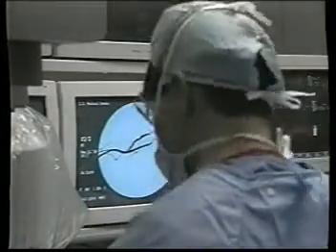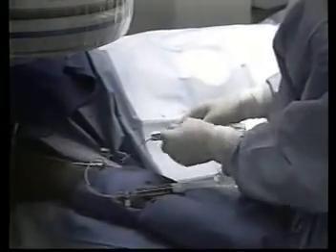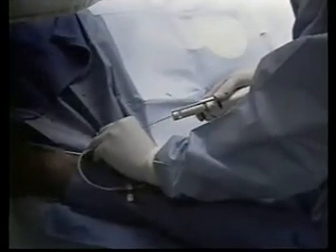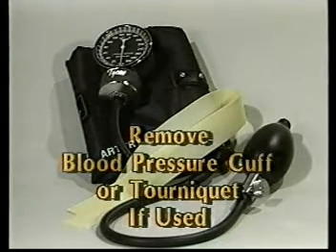Aspirate approximately 10 cc's of homogenized clot from the arterial sheath and discard the aspirate. Inject contrast to assess the degree of thrombus removal. Treat any residual thrombus using the PTD via either the venous or the arterial sheath as needed. If a blood pressure cuff or tourniquet was used, deflate the cuff and remove it.